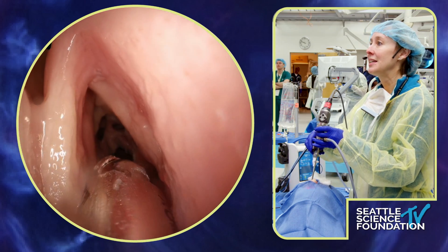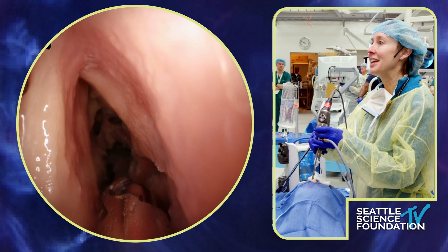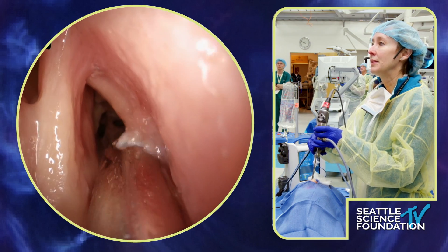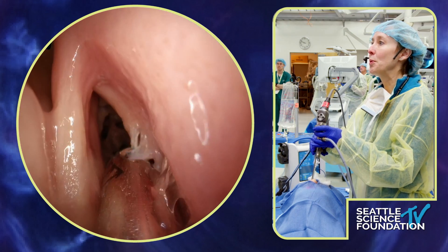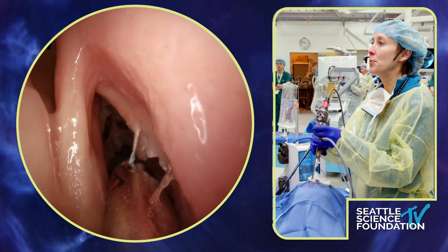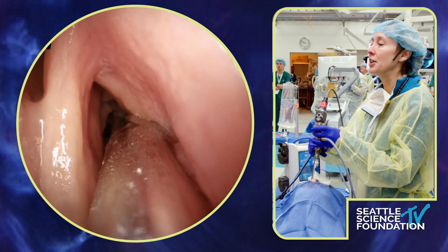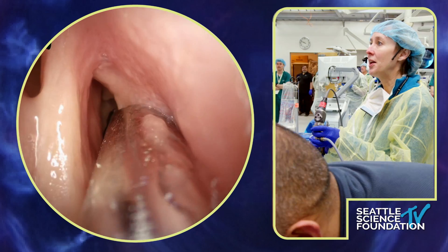There are a lot of different ways to do this. If you wanted to save this as a graft, you would obviously take it out as a whole piece. The degree of how much of the uncinate you'd like to remove partly depends on what the rest of your dissection is going to be. I'm going to leave a little bit at the very top just so that for the frontal dissection you have that anatomy as well.